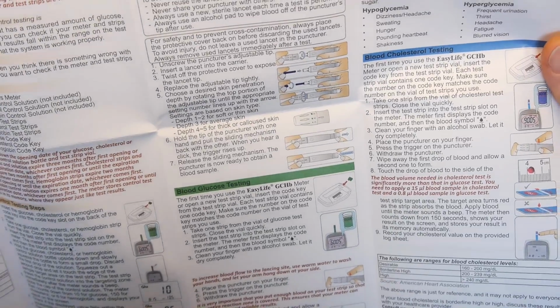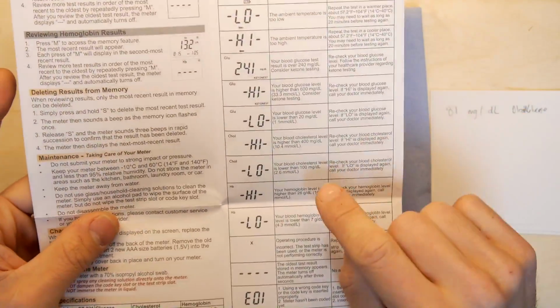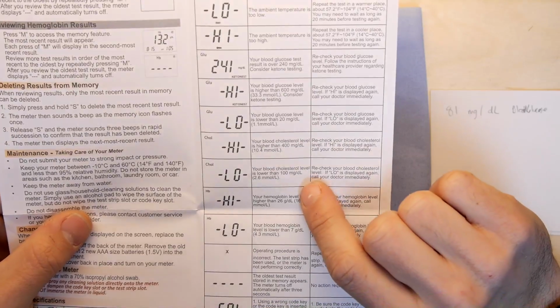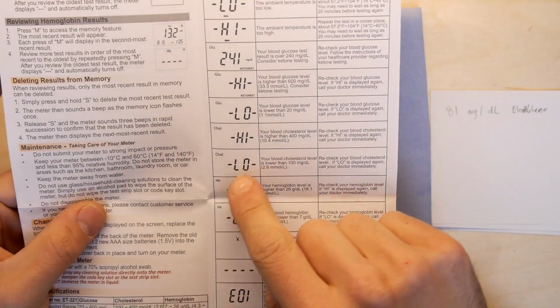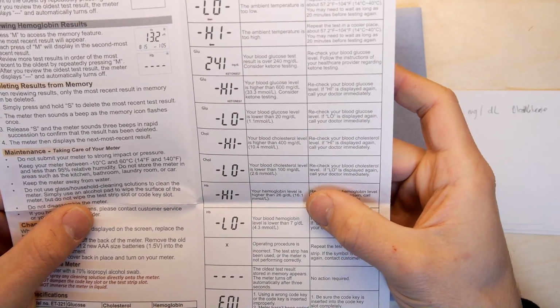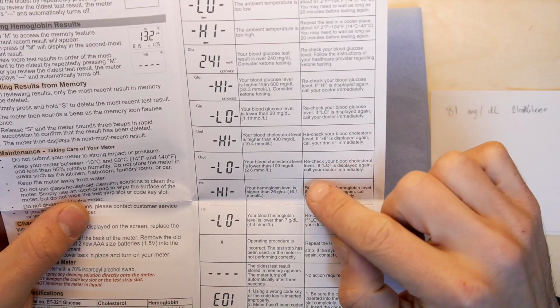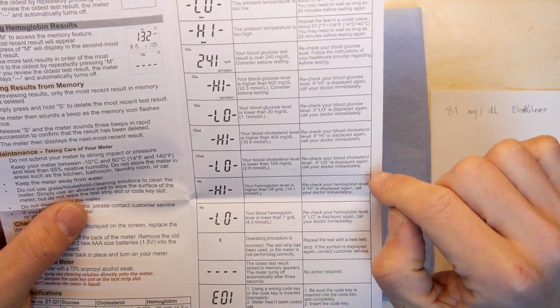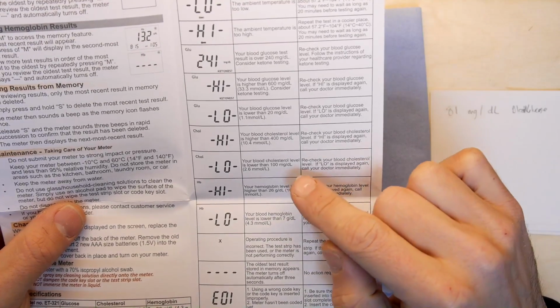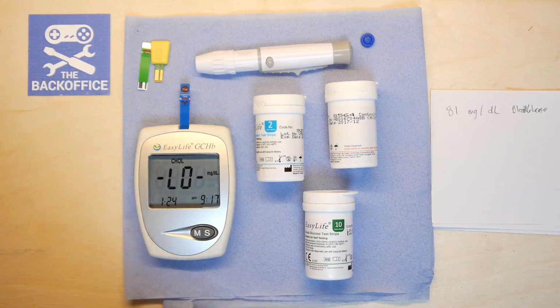It's an expensive test strip, so I might just have to think about what I've done. Oh, here it is. Actually, your blood cholesterol level is lower than 100 milligrams per deciliter. So that's good. Recheck your blood cholesterol if low is displayed again. Oh, hang on. Recheck it if low is displayed again. Call your doctor immediately. So basically it's saying you've screwed up the test. You've knackered the test. Fine. Okay, let's just move on.